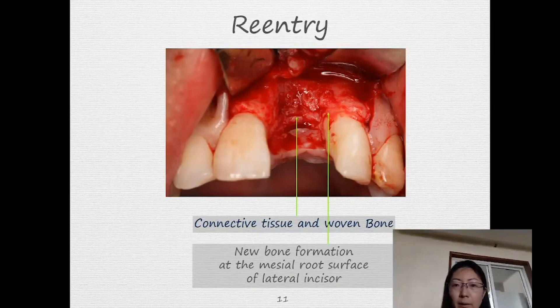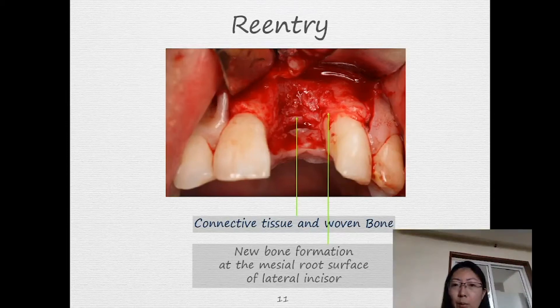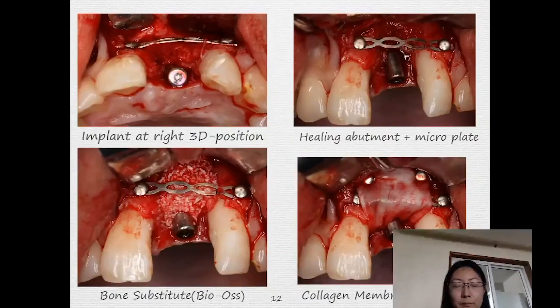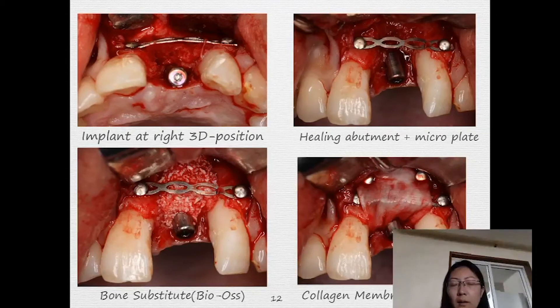An inspiring result of this patient: we can see new bone formation at the mesial root surface of the lateral incisor. We have already scraped away all the soft tissue, but here there is still some red-colored tissue — it is very solid; it is new bone formation. So we can put the implant at the right 3D position, and during the same time we place a healing abutment and another new micro plate to maintain the space.